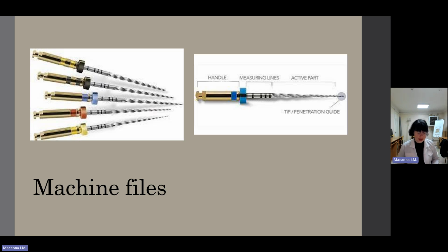A positive rake angle results in more effective cutting, but if the rake angle is excessively positive, the cutting blade will dig into the dentine substrate. Therefore, the rake angle should be only slightly positive.